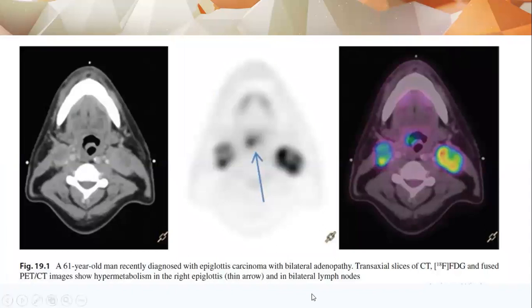This is an example of a 61-year-old man recently diagnosed with epiglottic carcinoma, presented in the axial CT scan, axial PET, and a fusion FDG PET-CT. There is a focal area of intense hypermetabolism in the right epiglottis associated with bilateral cervical lymph nodes.